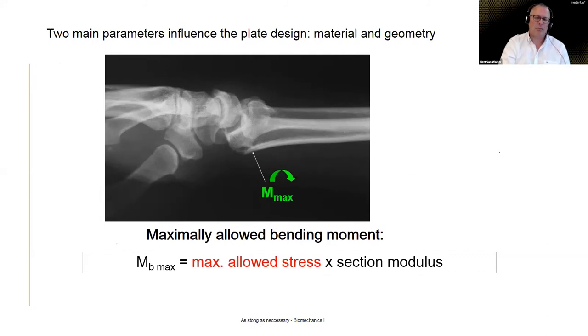And there you had the problems actually with what's called adhesion or bony ingrowth onto the implant, which means you had to chisel the implant out when you wanted to remove it. Now, these days, I think we have quite a good understanding. And again, all titanium manufacturers have their own little recipe when it comes to finishing the plate surface to reduce the risk of bony ingrowth.